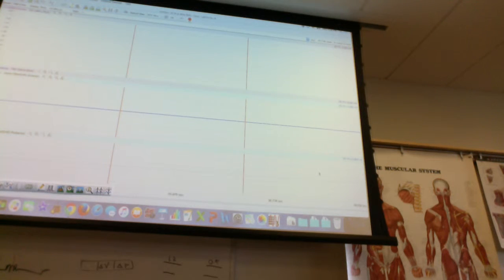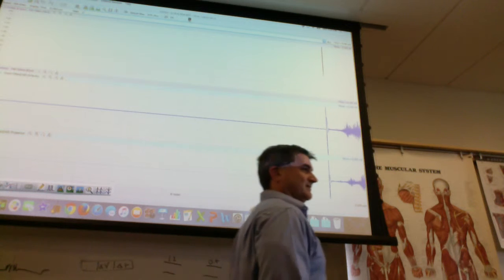Okay, is everybody hooked up? Okay, so the thing you're going to do next is you're going to hit the record button, which is that little red thing on the far right. It's on this computer screen. So way up there at the top. Yeah, there you go. So the people at station one over here, we're watching their recording. So let's click on that. We should get something. Okay, let's see. All right, there we go.